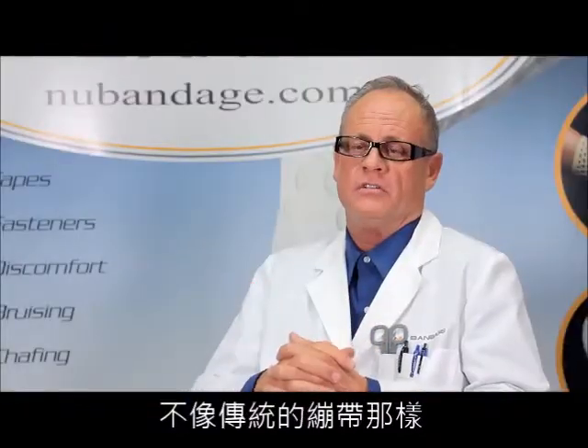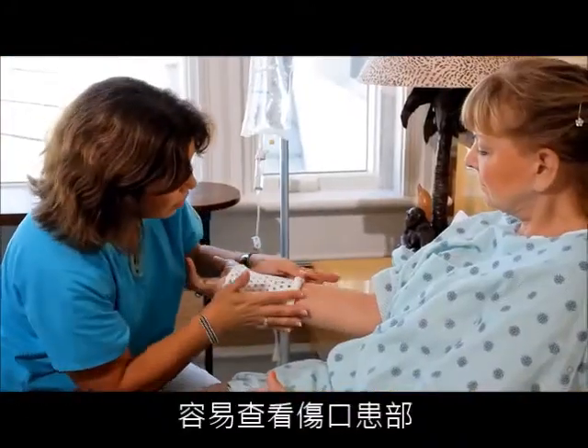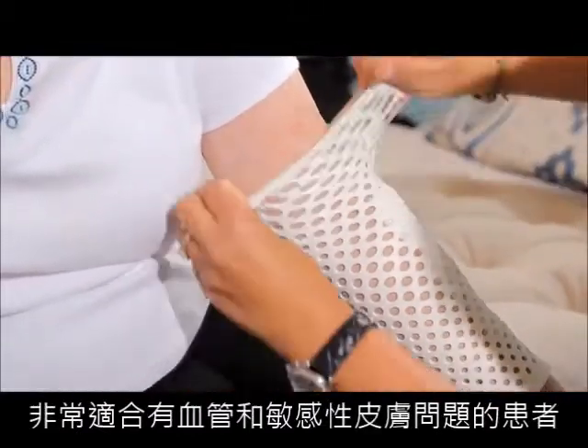Unlike traditional cloth bandages that trap body heat and perspiration, New Bandage allows for excellent airflow with easy access and visibility to the affected area, and it's perfect for patients who have vascular and sensitive skin issues.